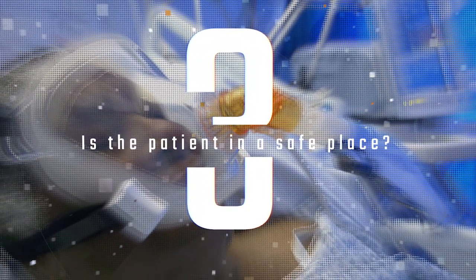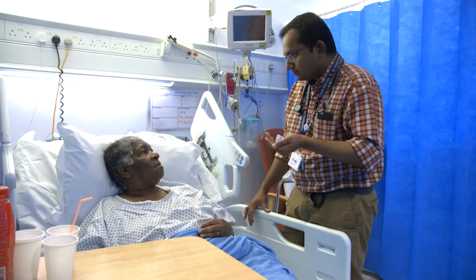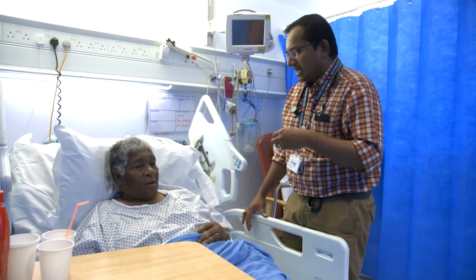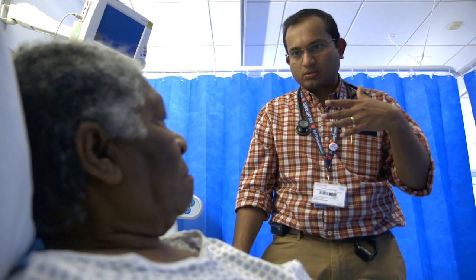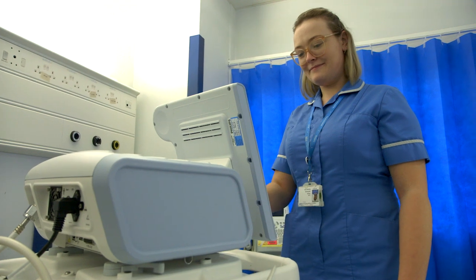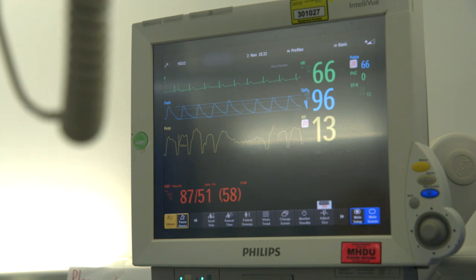Thirdly, is the patient in a safe place to administer NIV? Patients being treated with NIV are acutely unwell and have the potential to deteriorate rapidly. Starting a patient on acute NIV may initially make the patient worse — for example, EPAP can often decrease a patient's blood pressure. Therefore, it is essential that the patient is in an area where they can have continuous monitoring, including heart rate and saturations monitoring, and that they are set up by someone competent to do so.